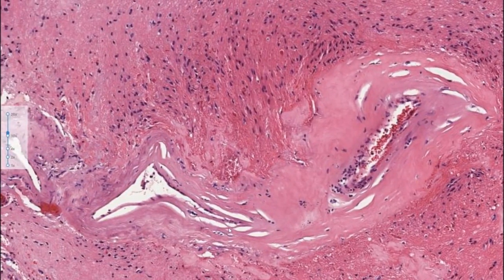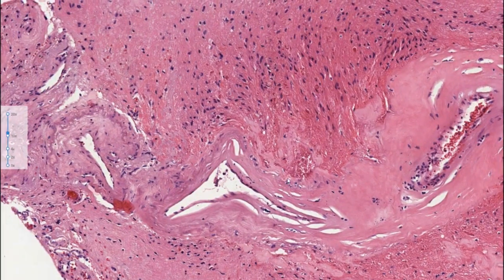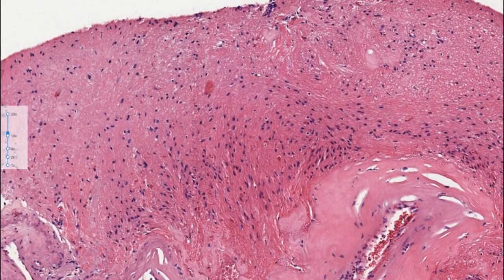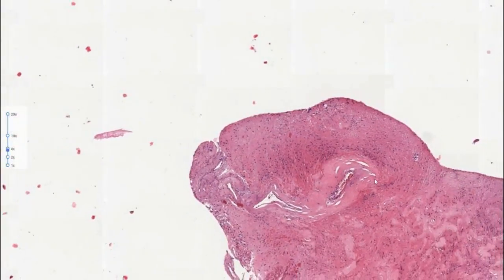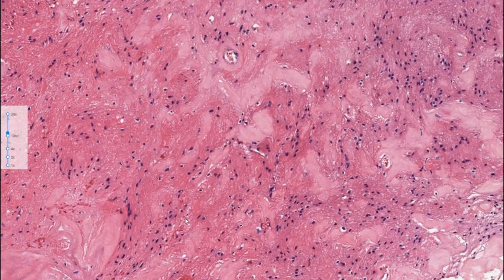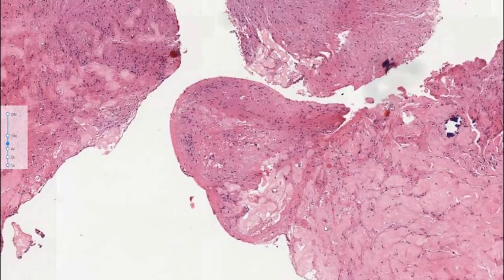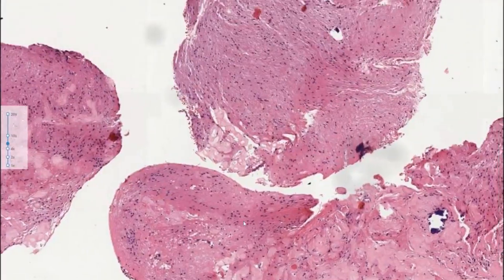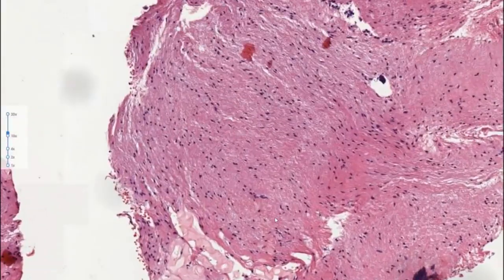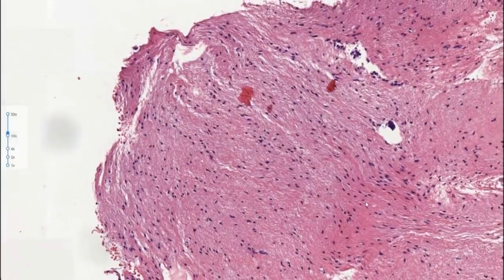And this is a feature that I want to highlight the most here in this particular case, is that you do have a very compact area of gliosis. And here it extends here, a lot of hyalinized vessels. In this case, it's very easy to go in the direction of a glioma or a pilocytic astrocytoma. You have more of this here, vascular hyalinization, increased cellularity of the glial component, and even some atypia, you may argue.